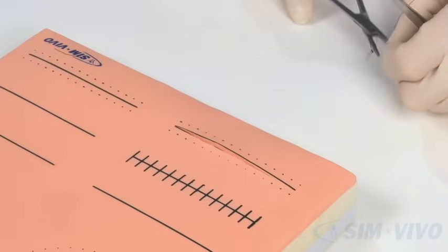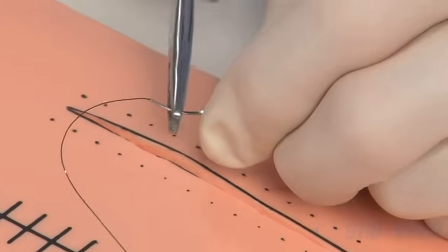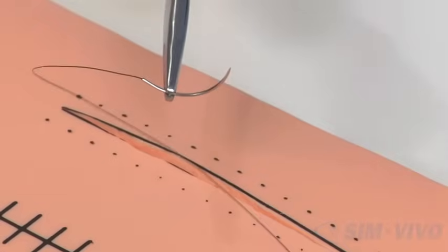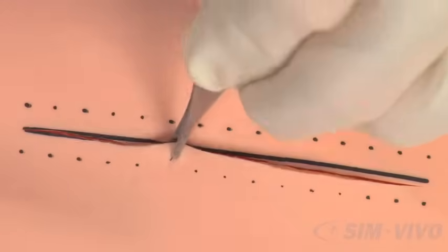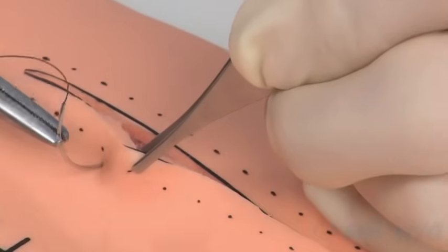We do that in a very standard fashion. Using the small 24mm needle, load it in the usual fashion. Perpendicular, about two-thirds of the way down, and then pick a dot in the center of the wound. Notice in this case we will put the suture a little farther away from the dot than you normally would.